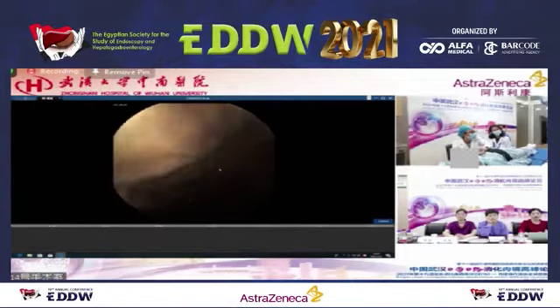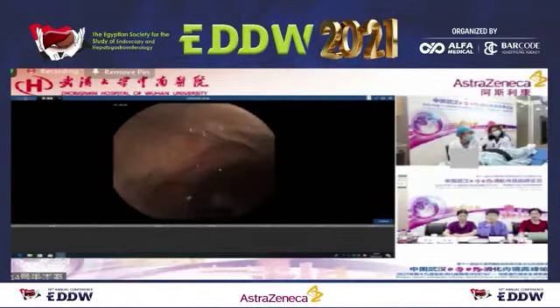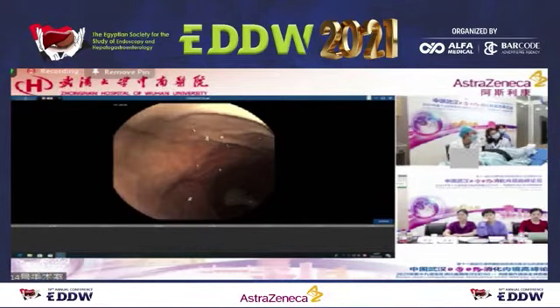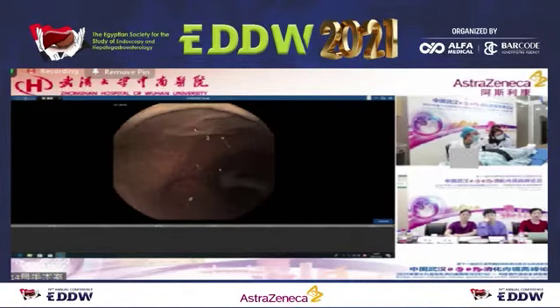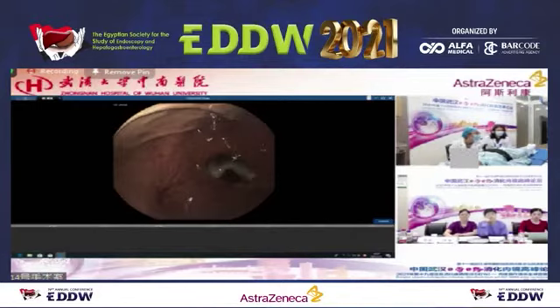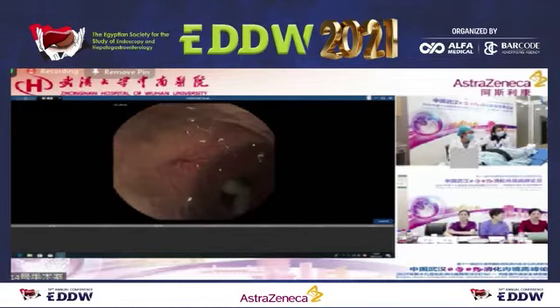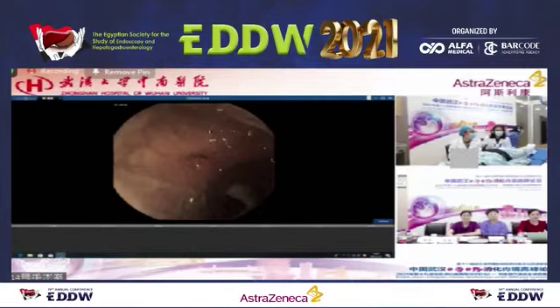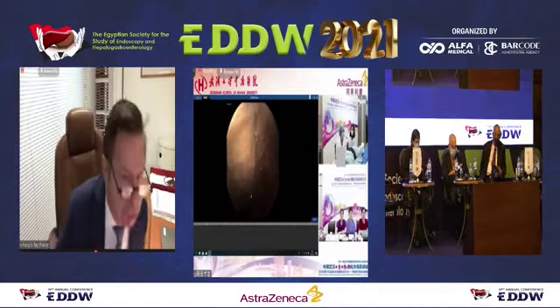In the procedure, we can communicate with the patient and ask if she has any complaints. Usually, she can feel nothing. Okay, it's the cardia. I think today it's the nearest position we can get, but I think it's clear enough. Are you satisfied with this image? Yes, it's a good image.